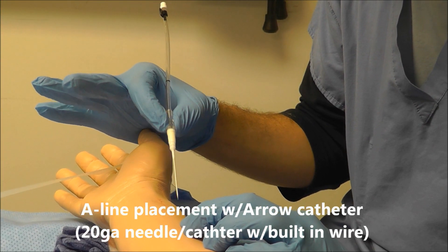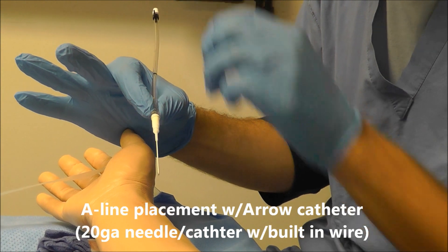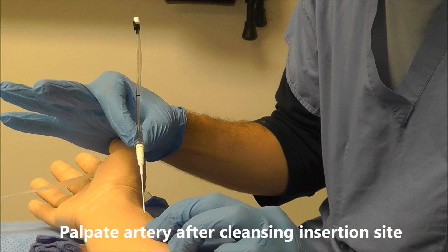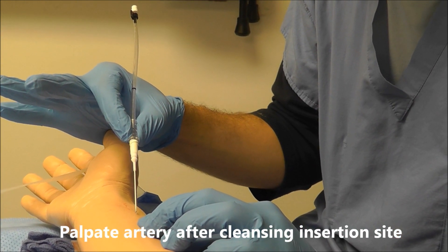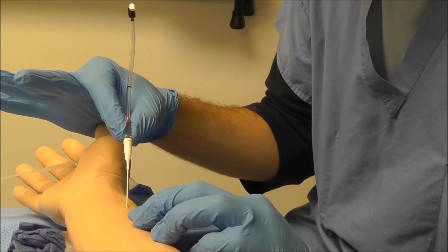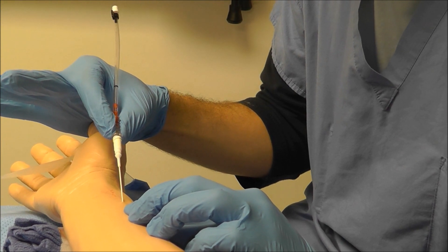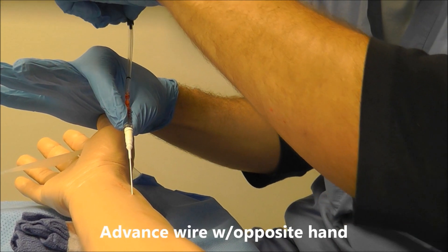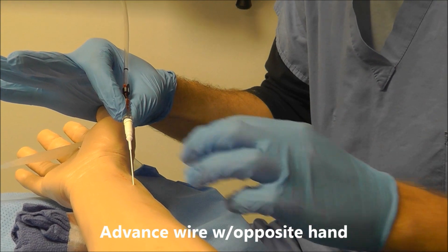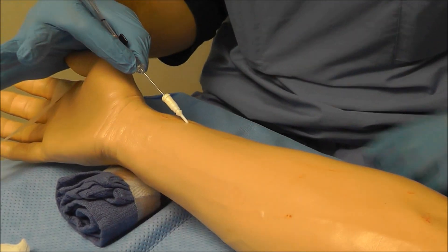For this type of A-line, I'm going to use an arrow kit that's got a wire. I'm going to feel the pulse here with my non-dominant hand, going at a roughly 45-degree angle until I see a flash of blood. So I've got my flash of blood — now I lower my angle a little bit and advance this wire. Once that wire's in, I should be able to just advance the catheter over the needle.